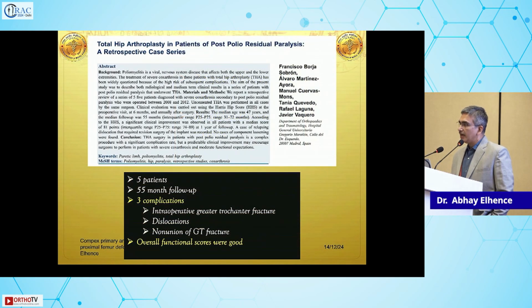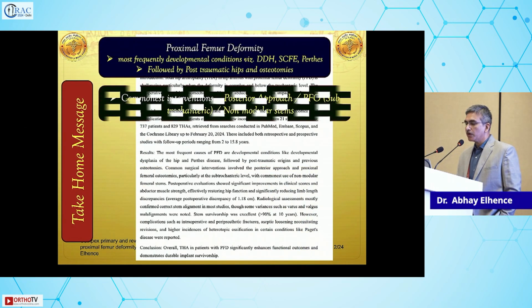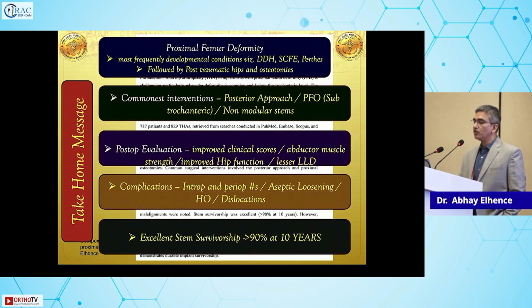So tailor your solutions to individual problems. That is very important. More importantly, you have to know what is the etiology of the problem, what is the anatomical source of the complexity of the problem that is presenting to you. You have to choose the right approach for your different situations. You have to factor in what is your plan A, whether you're going to use modular stems or non-modular stems, or what kind of versional issues you need to address on coronal and sagittal planes.